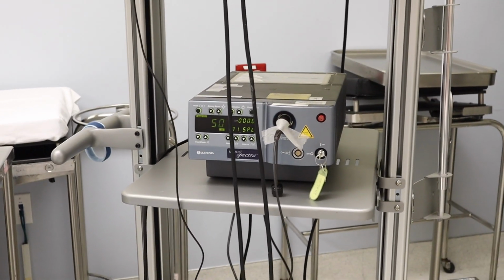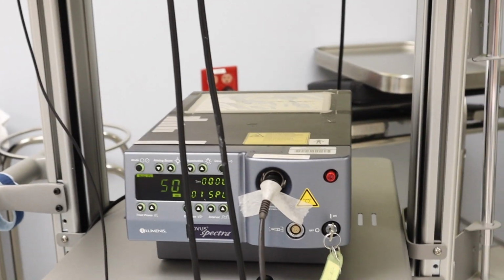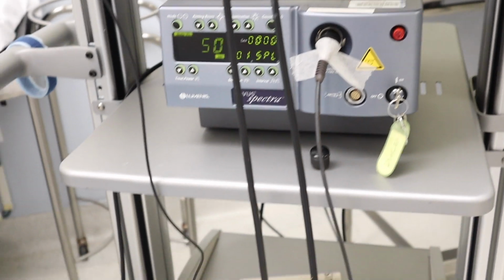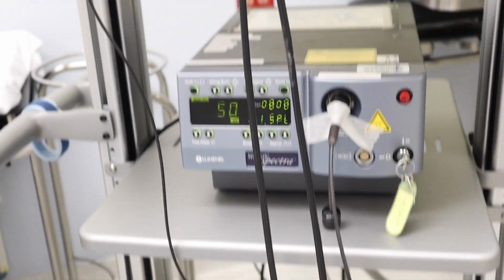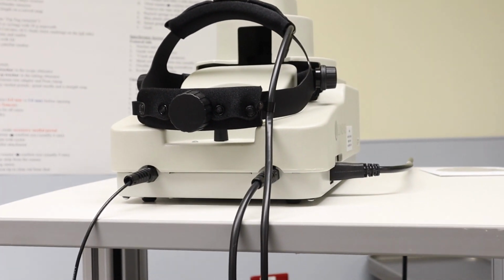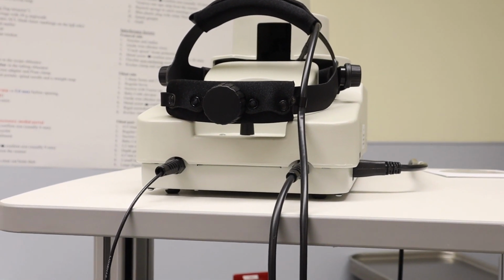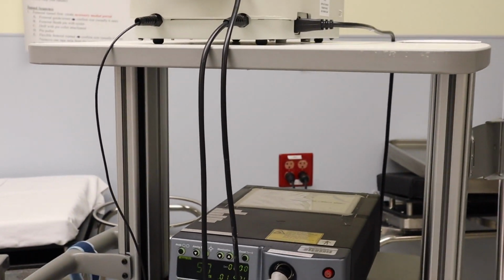So this is the laser machine, it's nice and quiet. This is what we use to do laser for retinopathy of prematurity. So it's got a little foot pedal right there. And then this is the headset. It's very heavy. So I do have to take breaks usually because you're trying to put in about 1,000 bursts of energy, 1,000 laser shots, in each eye.